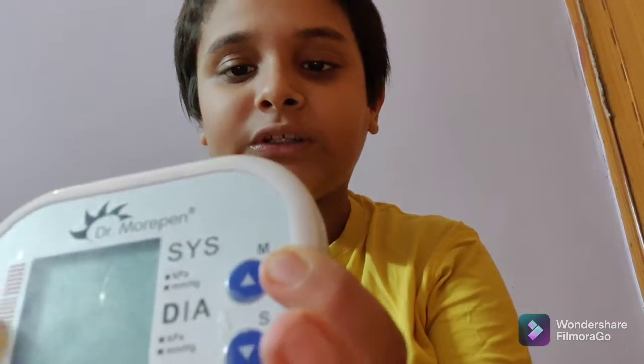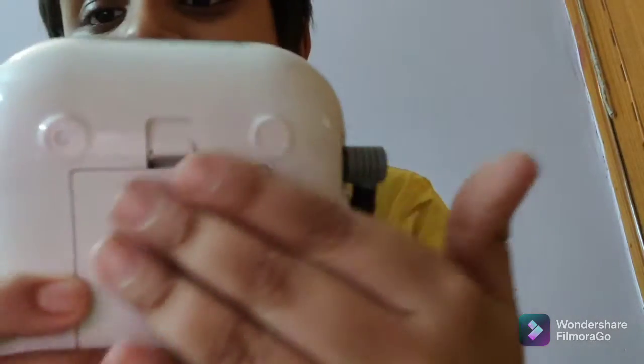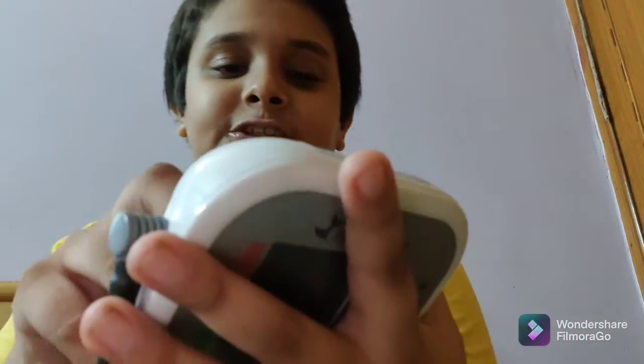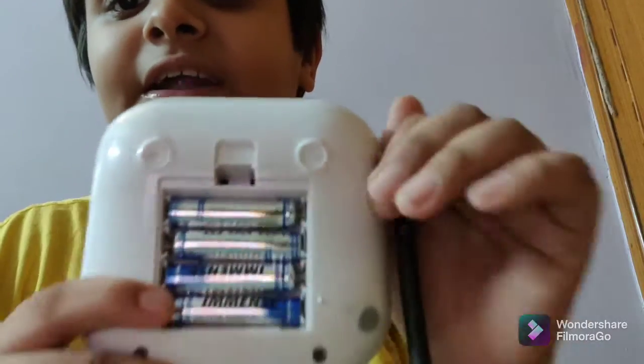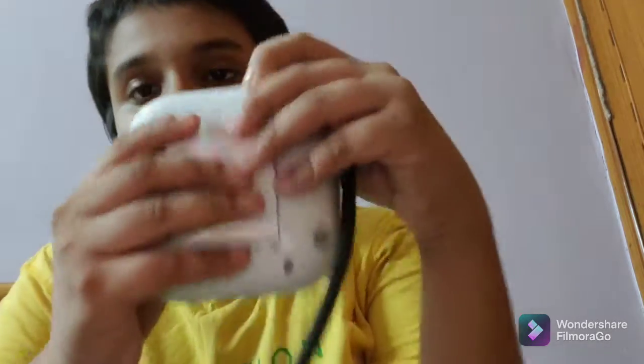The model number is BP-02. There are other details on the back but the main thing is that model number. Moving on, we have the battery panel where you can simply insert your batteries. Since it's digital, you need batteries to make it work. It takes four triple-A batteries — I inserted four triple-A batteries to make it work.